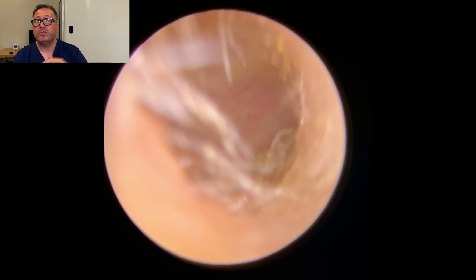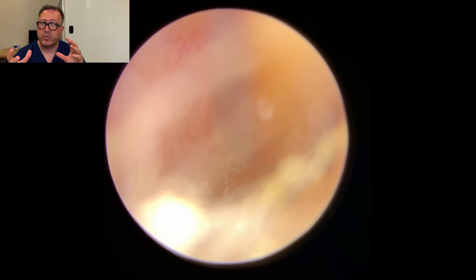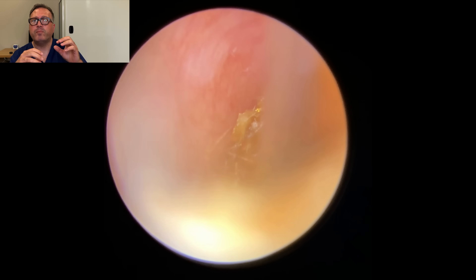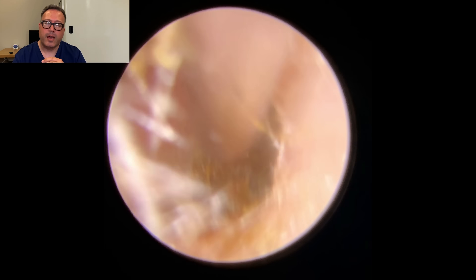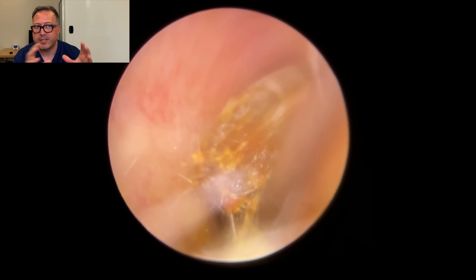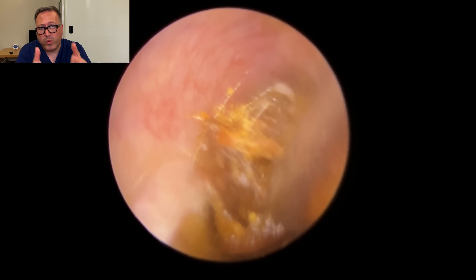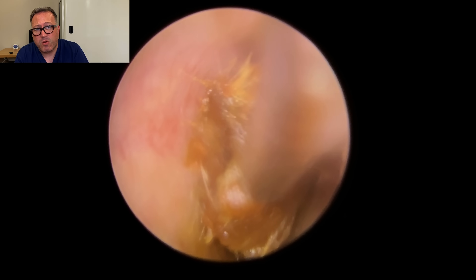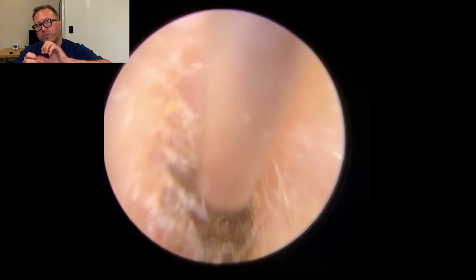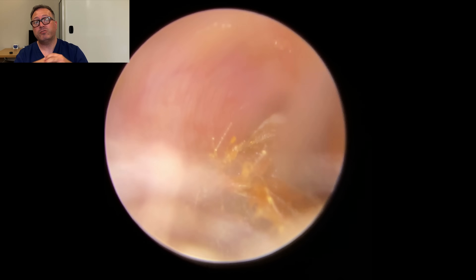This lady had actually been to a GP complaining of reduced hearing. She also had a little bit of musical tinnitus, which is not quite as common as the kind of regular rushing and whistling you can get. But the GP said the ears were completely clear. So a little bit frustrating from our point of view because we can see in here — we can see the wax — and this poor lady's been suffering for months and months like this. We're just starting to lift the base now — we've got a large section there on the move. Can you see how it moves when you pull it — how it bends and flexes and then flicks back into place — giving you a good indication of how tough this is.